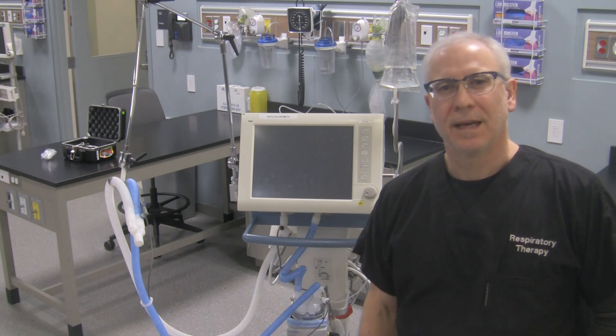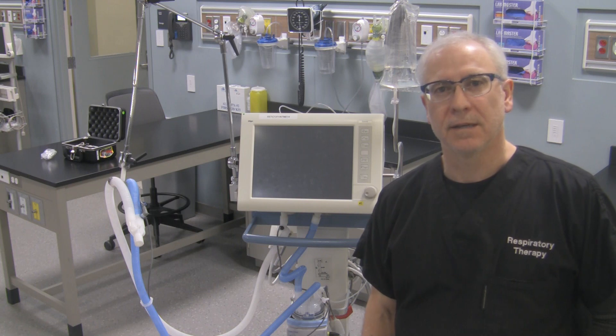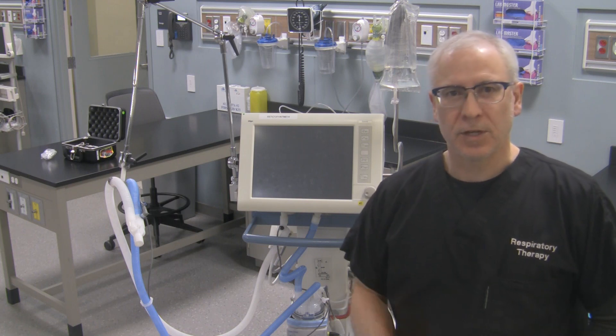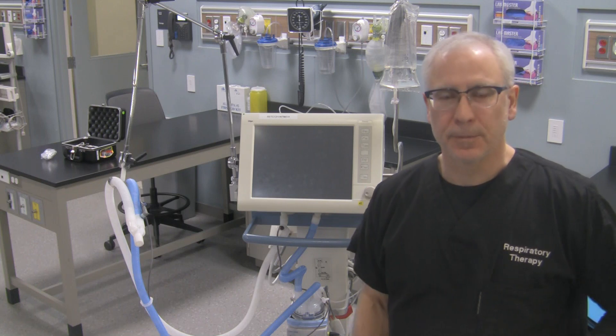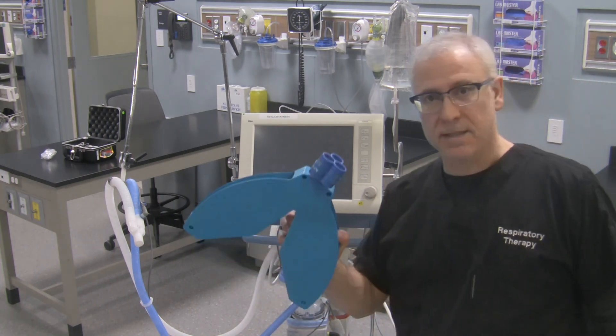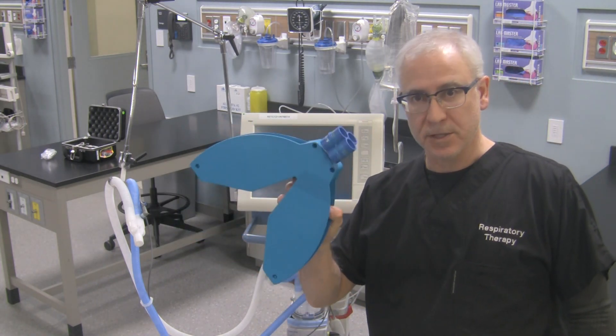Hi, George here. What I'd like to do in this video is do a pre-use check on the Evita XL ventilator made by Draeger. Now in order to do the pre-use check on the ventilator, there are a couple of things that you're going to need. One of the things you're going to need is a test lung like this, or some variation of a test lung.